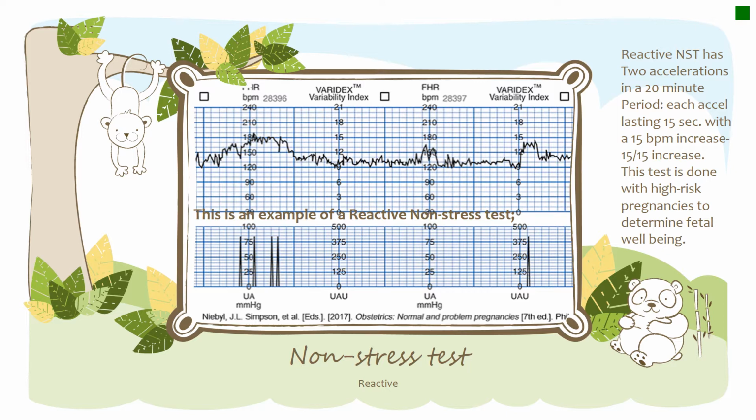So things we have to watch for would be an absent fetal heart rate, say they're not having accelerations. We have to think maybe they're sleeping, mom is taking a depressant med, or chronic smoking. If mom's smoking, it can reduce fetal movement. Like I said, it's non-invasive. There are no contraindications to it, and it's very simple for mom to understand as well.